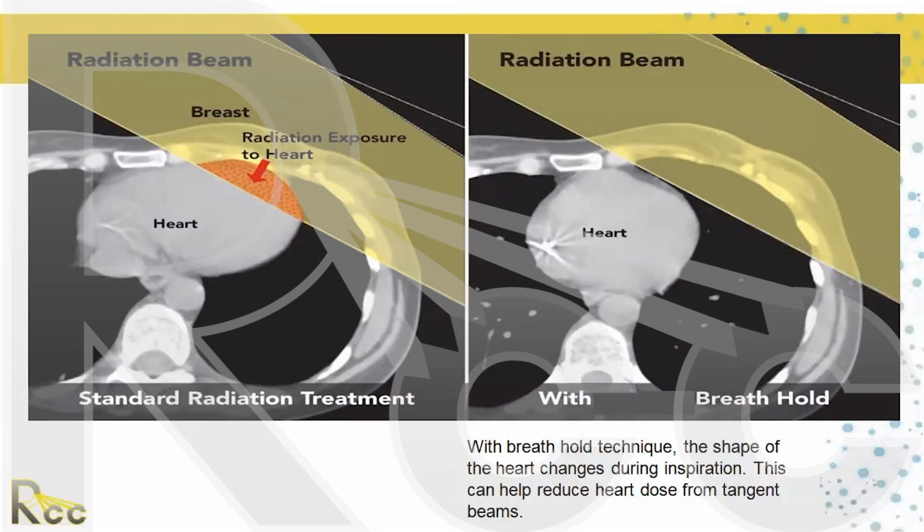In fact, a lot of the papers that came out at the beginning of intensity modulated radiotherapy, IMRT, were focused on head and neck cancer because the papers were showing that the side effects became minimal with intensity modulated radiotherapy because, say, for example, you could have better sparing of a parotid gland on one side.